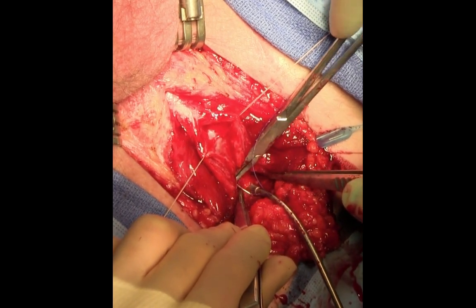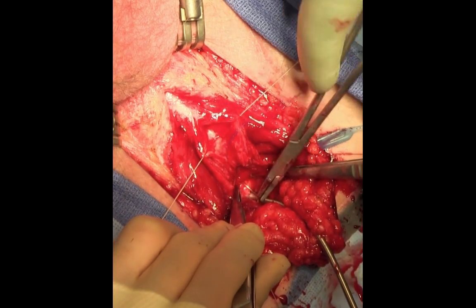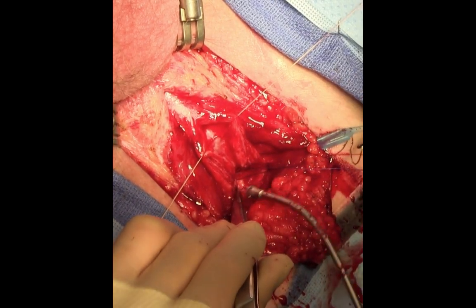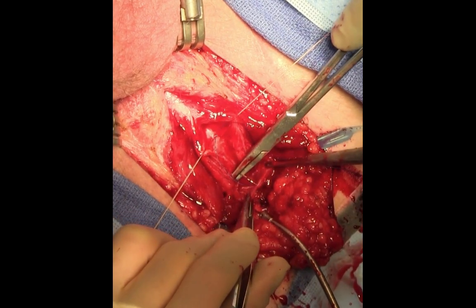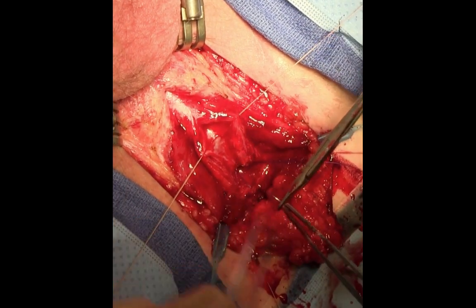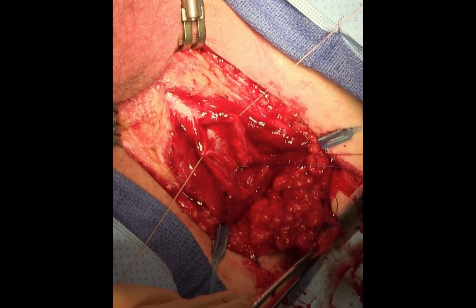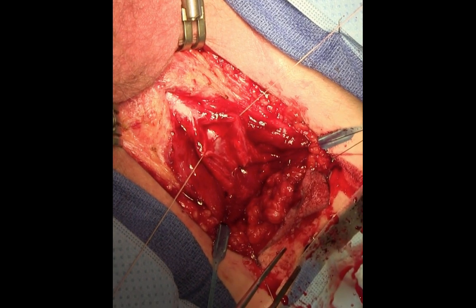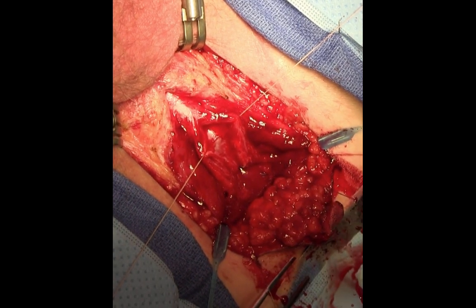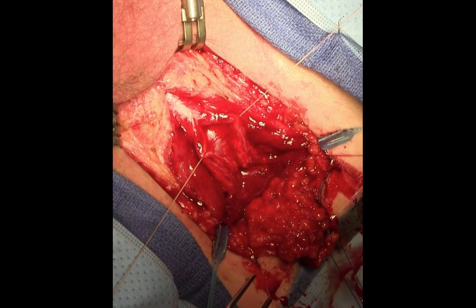Now three sutures are placed at the proximal urethrotomy, one in the center and one suture on either side of the center. Typically, we use 3-0 Vicryl for this purpose. It's important to incorporate the urethral mucosa and then the cut edge of the corpora spongiosus adventitia, and then skin. This is true of all the sutures that are placed between the skin and the bulbar urethra in creation of a perineal urethrostomy.